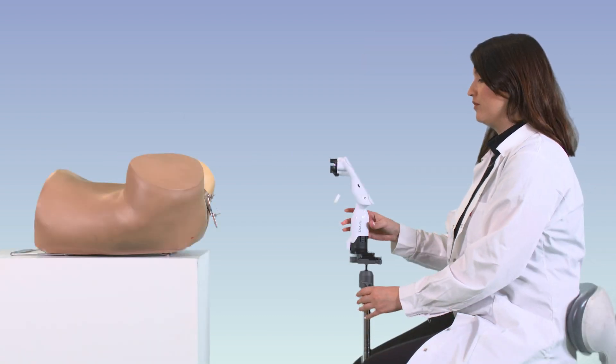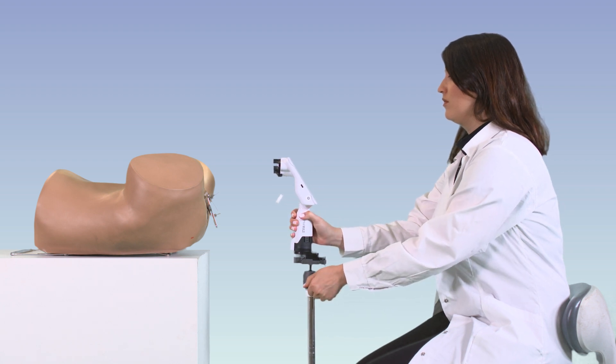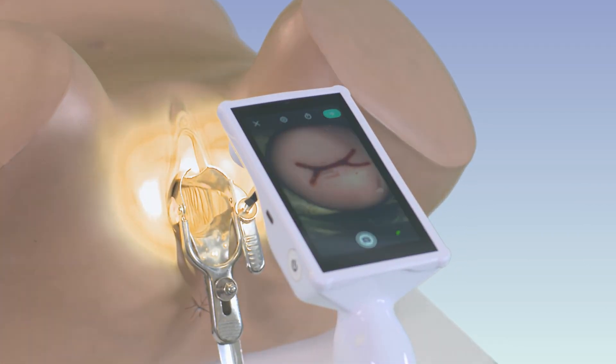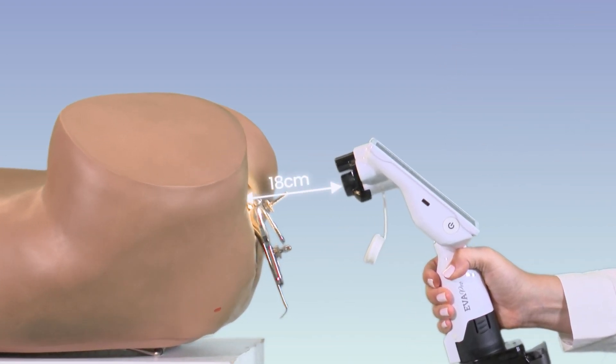For optimal image quality, make sure the colposcope is stable on the stand. Move the stand close to the patient and adjust the position of the device to obtain optimal visibility of the cervix. The recommended distance of the colposcope camera lens should be about 18 centimeters from the patient's cervix.